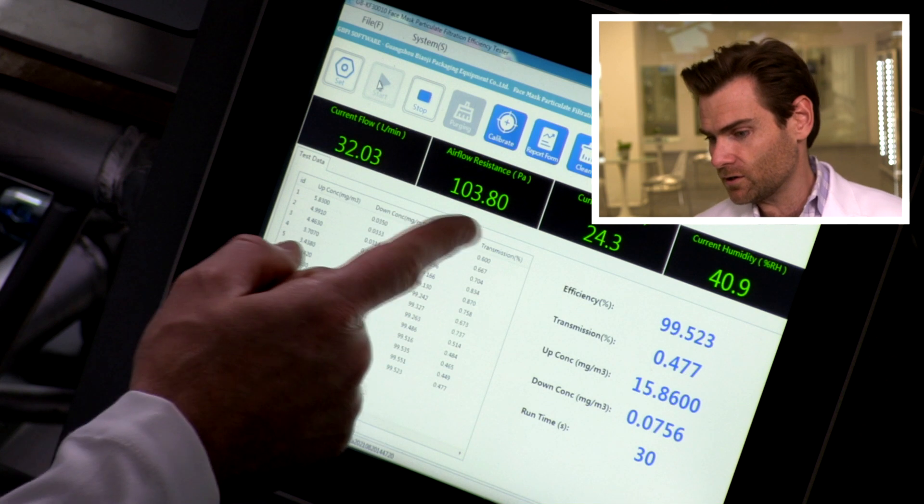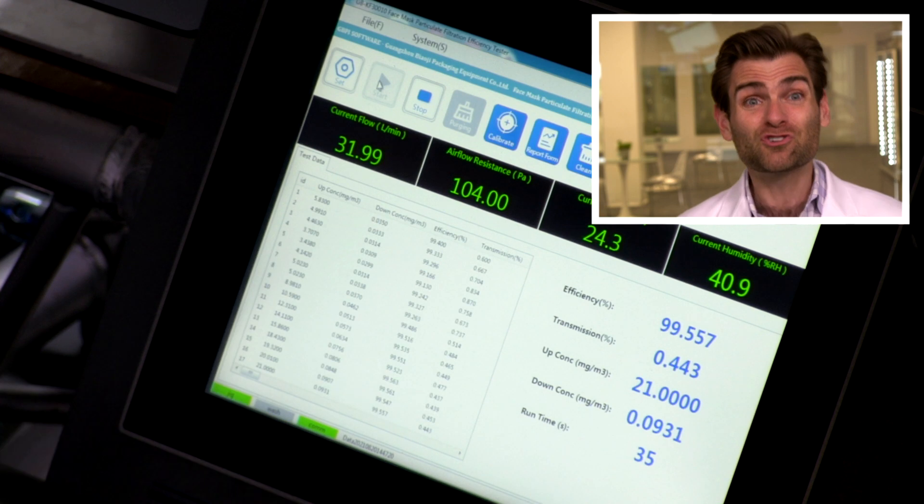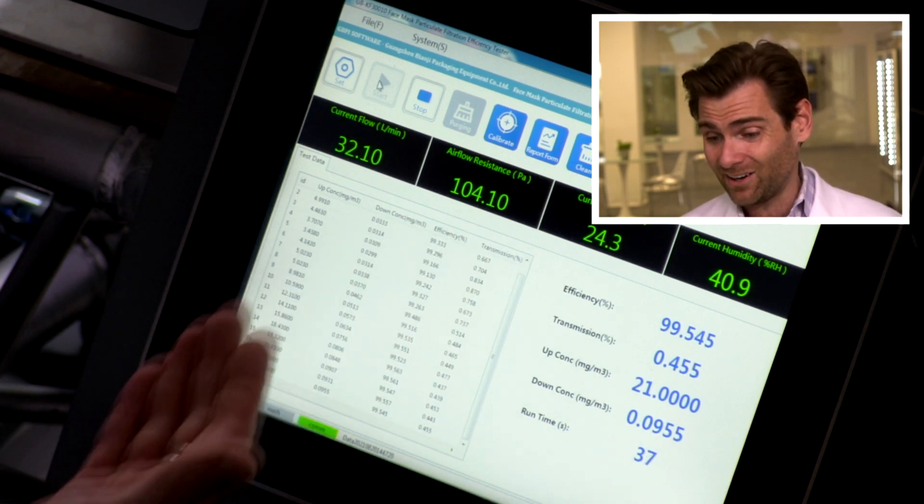This is going to show us the airflow resistance, which is actually really great — super breathable. We want that to be under 250, and it's at 100. I've seen some as low as sub-100, but that's really good, especially for being so old.